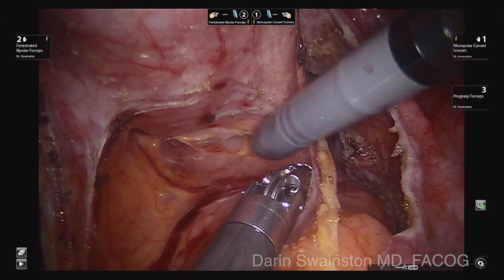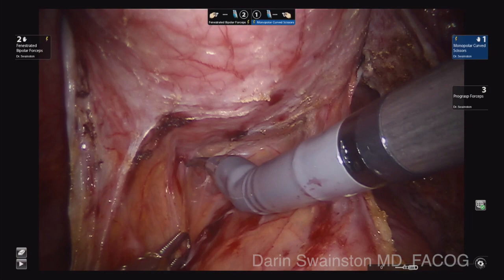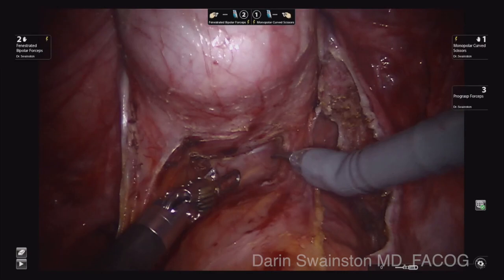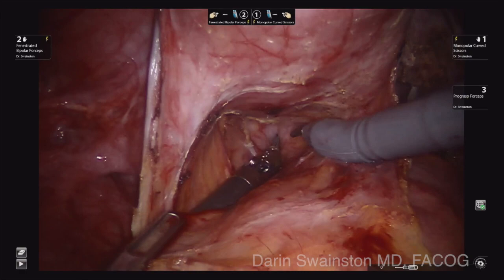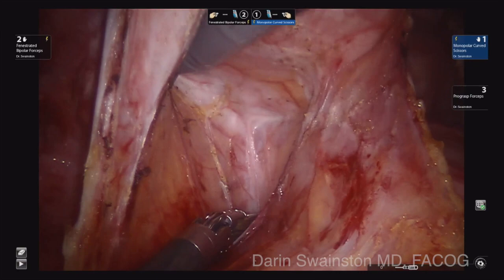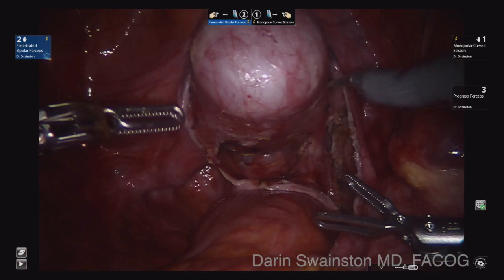At this point I am going to ask my partner to put his finger in right at the base of her perineum, just to get an idea of how low I am dissecting back here and whether I need to go down lower. There he is — he is right there, so I know I am fairly low at this point. The fourth level of support, the perineal body, is better taken care of with a perineorrhaphy or perineoplasty rather than trying to fix it from above. I am just making sure I have plenty of room down here and the width I need for that mesh.